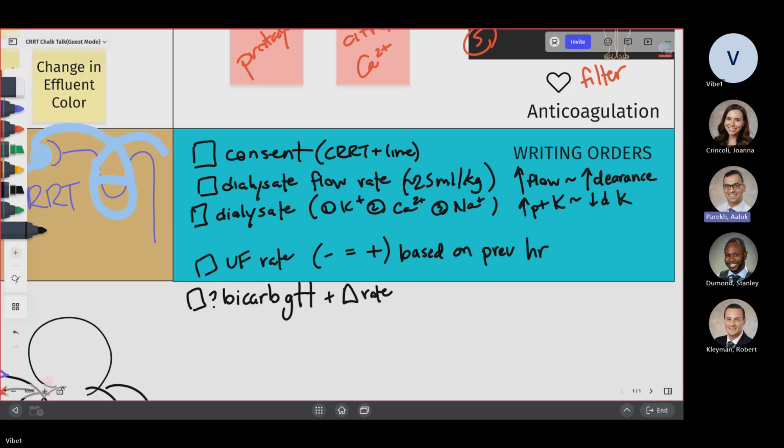And then same question, I guess, if we are giving bicarb, let's say there's access issues, can we also give that bicarb continuously post-filter in that same whatever HD access we have? I'll be very honest, we'll have to look into it. Nowadays, you guys use the trialysis catheters that have an extra port, so you can use that extra port, but this is something we'll have to look into, to be very honest. It's just for like the one patient a week where we have everything running and still have access issues.